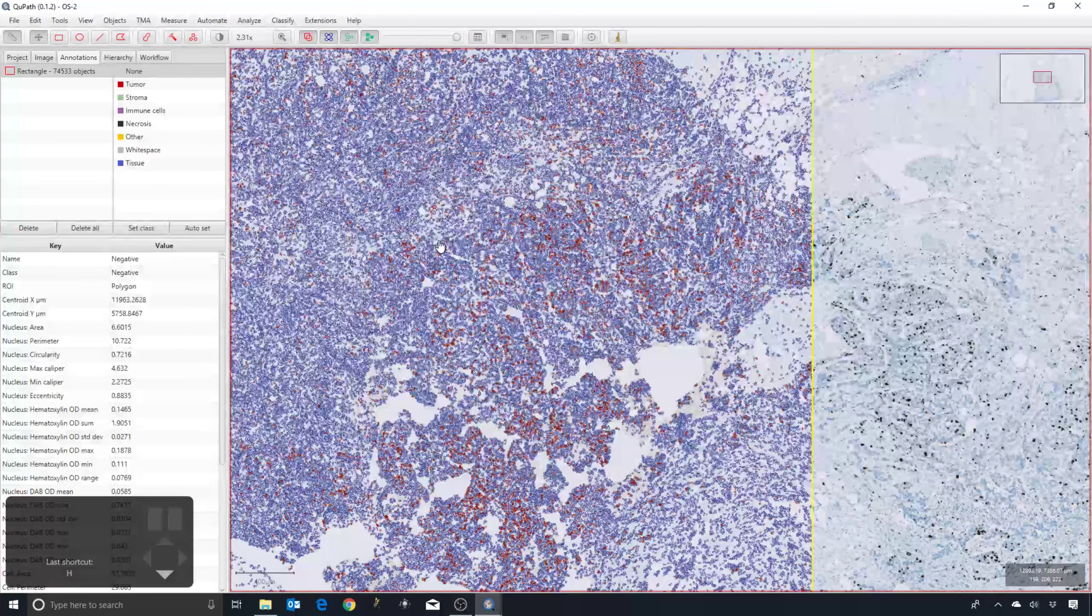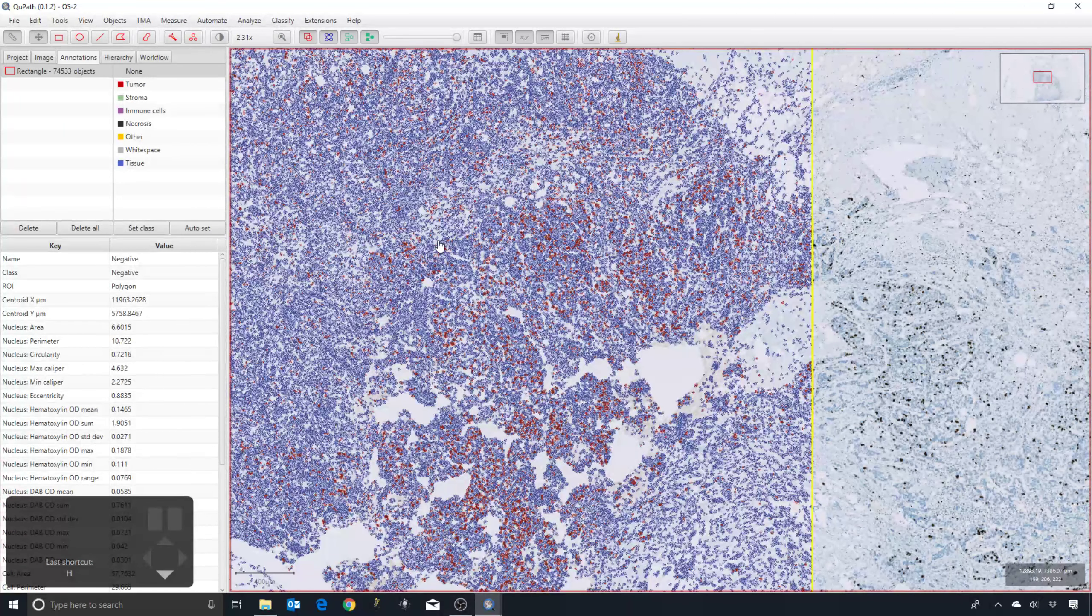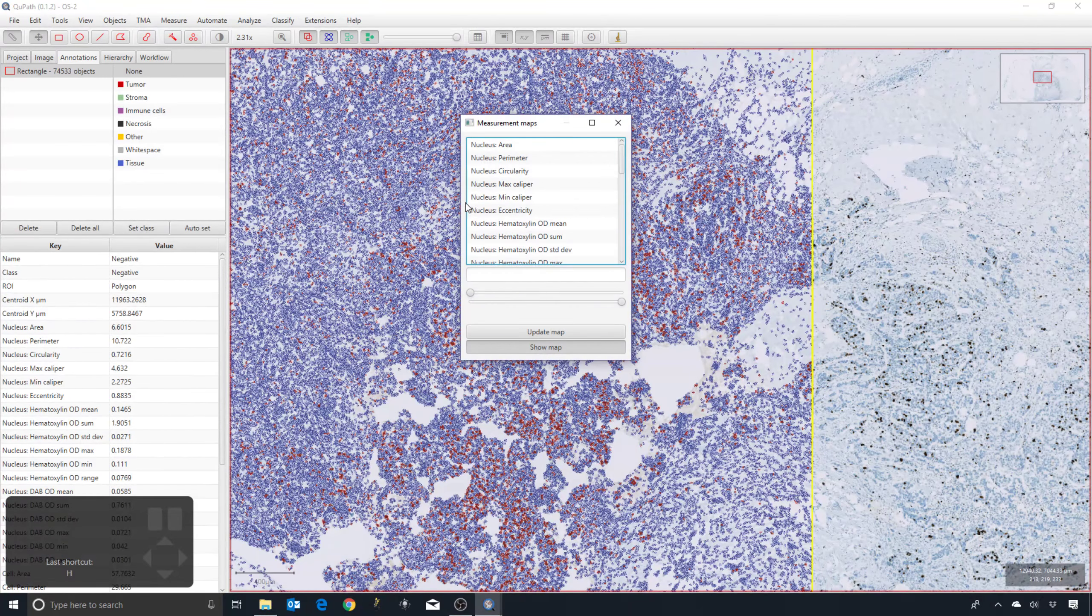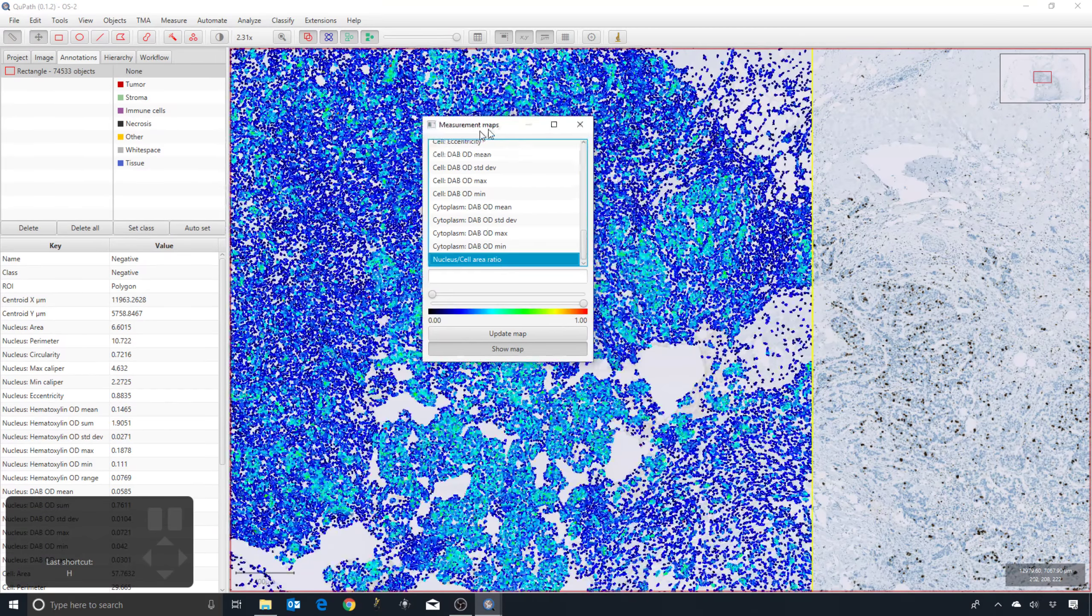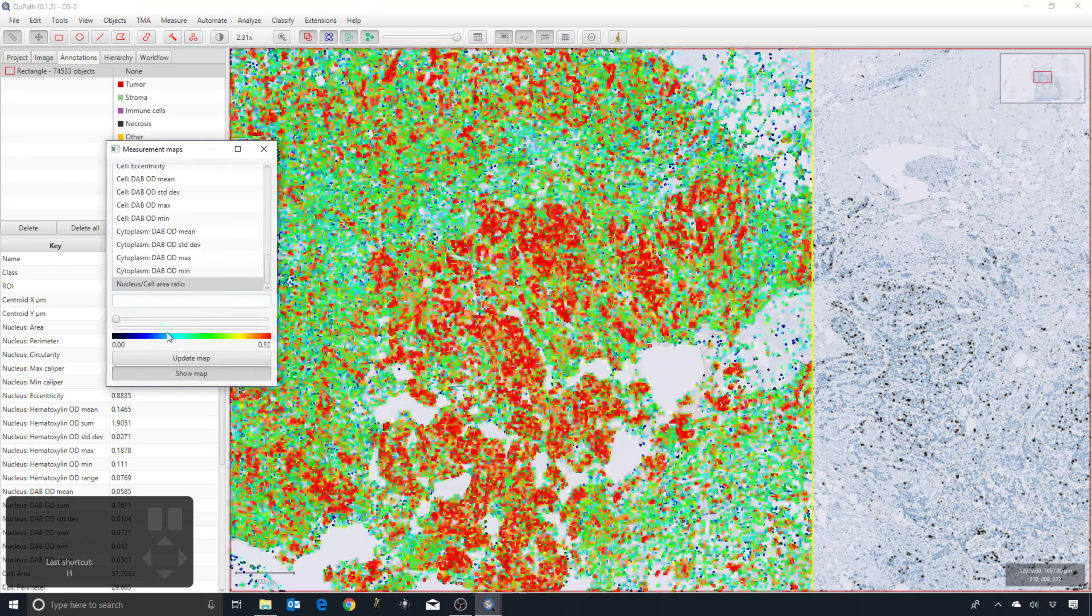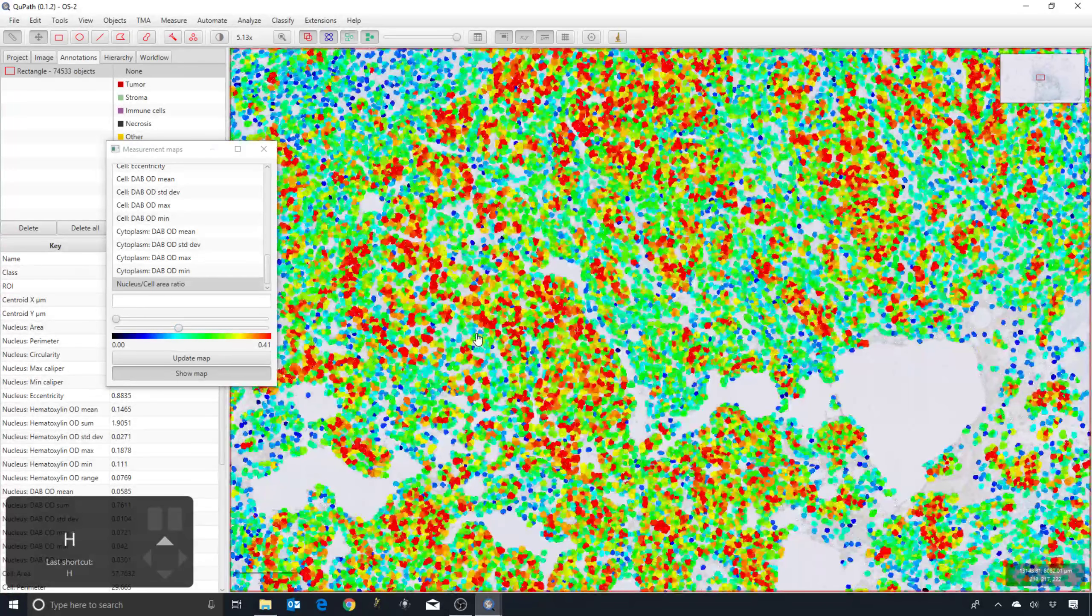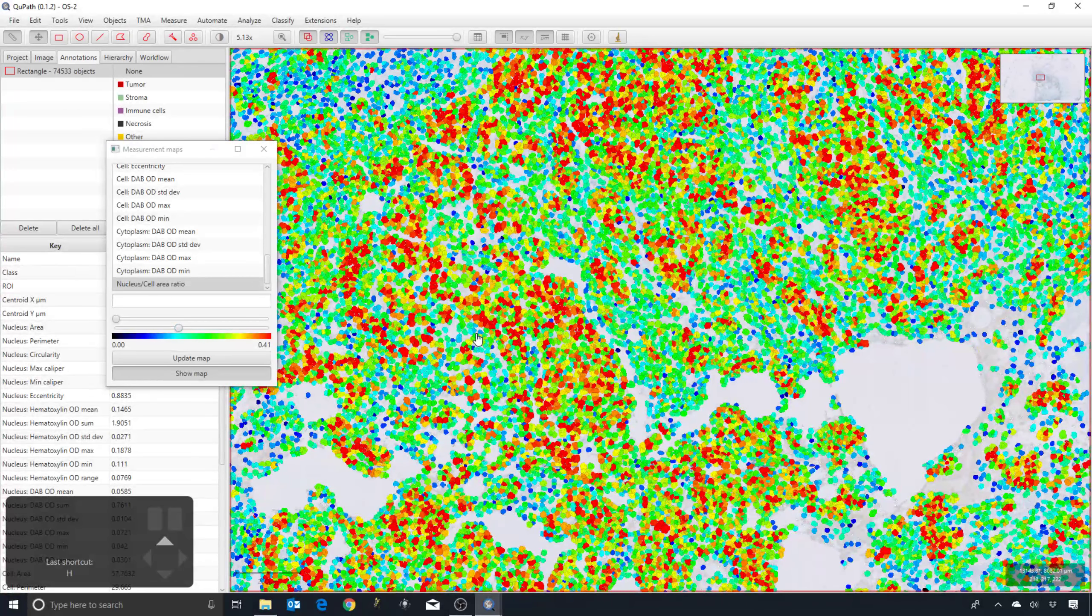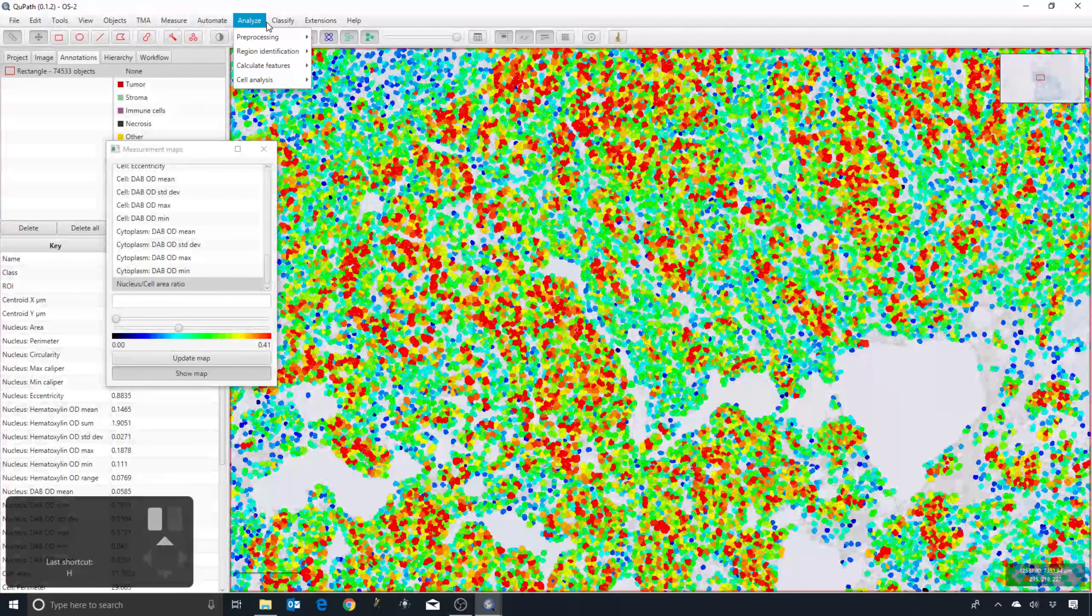Our measurements are made on a cell-by-cell basis, which means they can appear a bit noisy. We want to classify cells. We can do it on individual cell-by-cell measurements, but it may be helpful if we were able to supplement each cell with a little bit more knowledge of its surroundings.